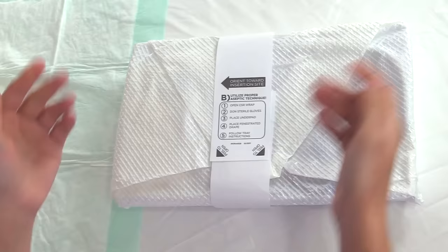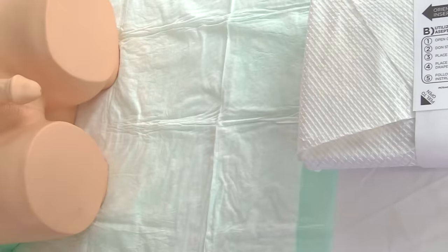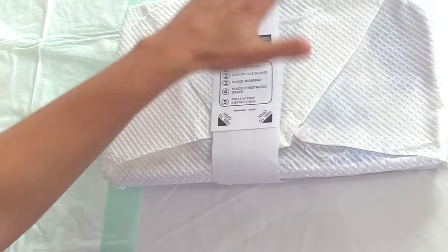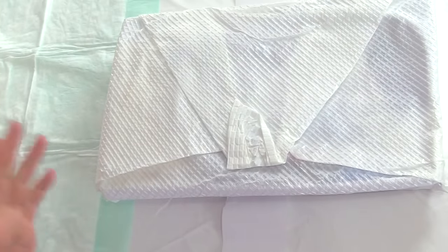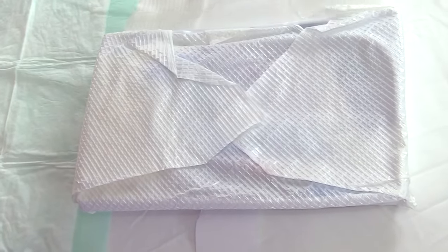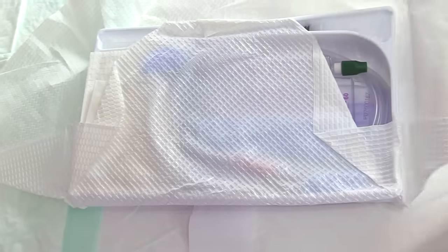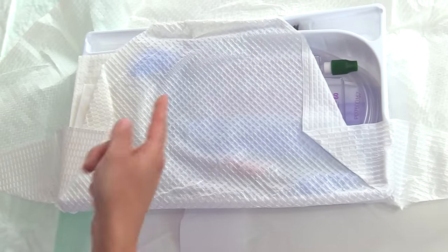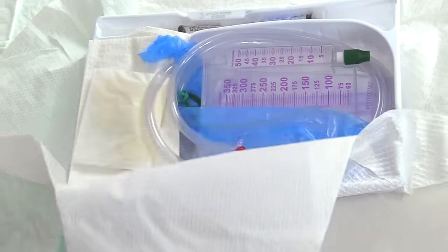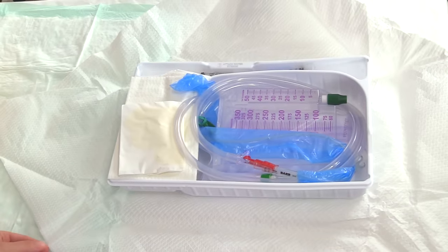Now I'm going to prep to open the Foley tray. I'll place the tray in between the patient's legs and orient it toward the insertion side, as indicated by the arrow. I'm going to open up the CSR wrap — the white wrapping — by peeling off the top tab first, then the side tabs, maintaining a one-inch border throughout so as not to contaminate the inside. Once open, extend the wrap fully if needed using that one-inch border.